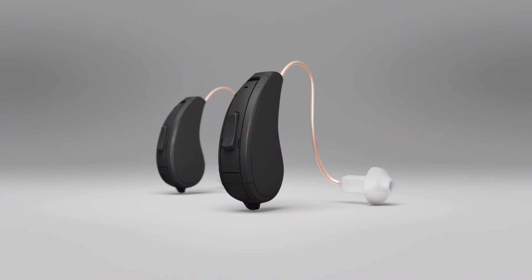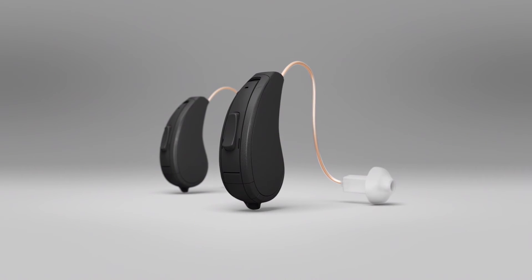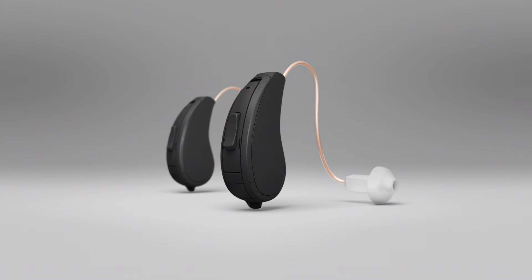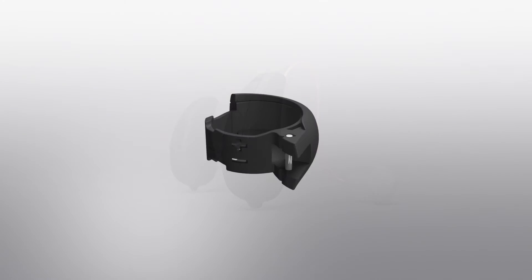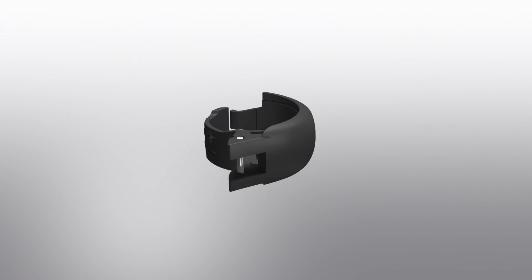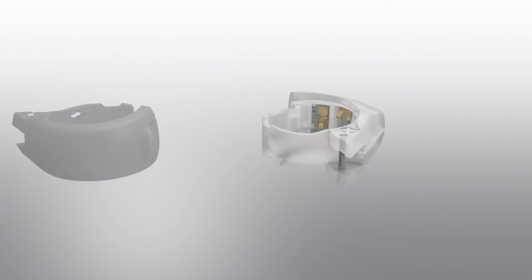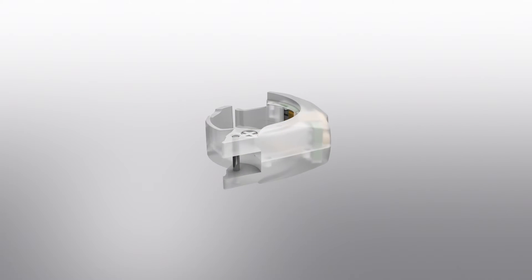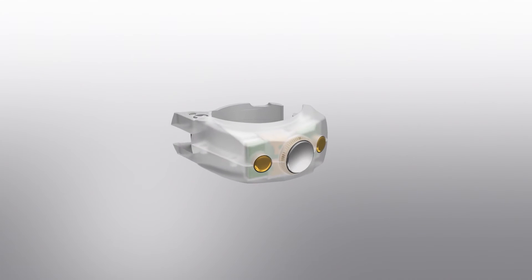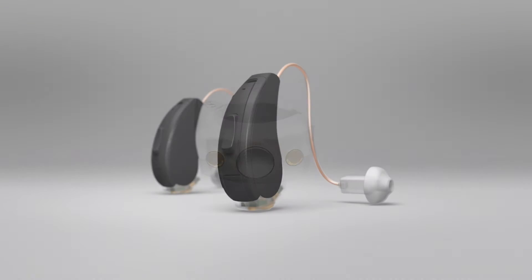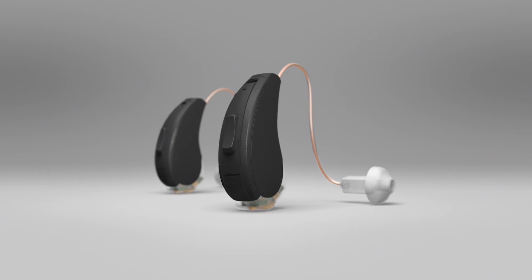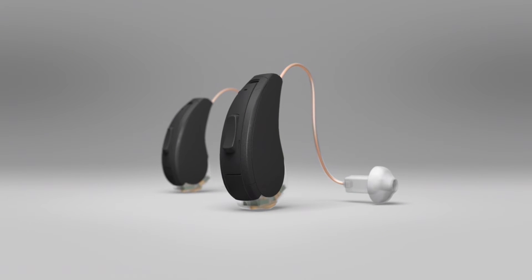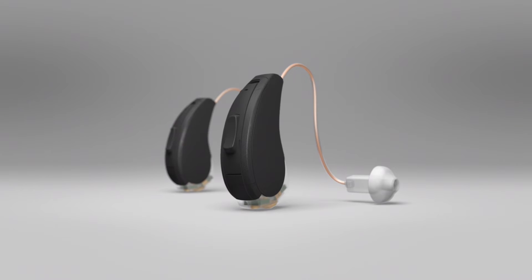In order to make a Beltone First or a Beltone Legend rechargeable, we are going to remove the current battery door and replace it with our Z-Power battery door module. This is a quick process and you'll be surprised at how easy it is to do in your office.